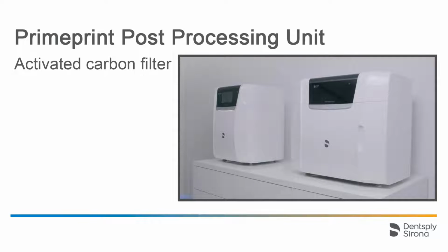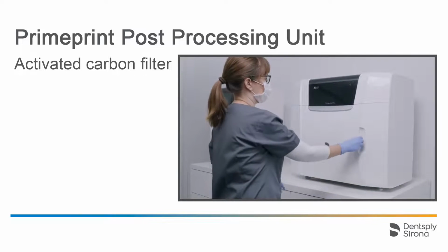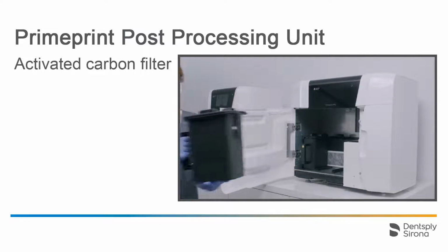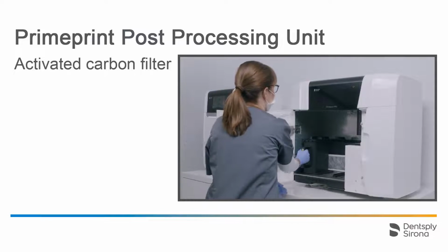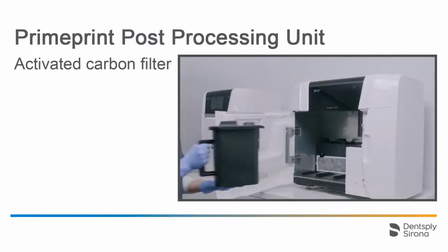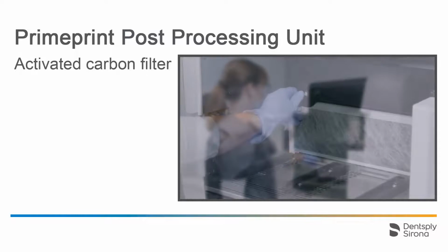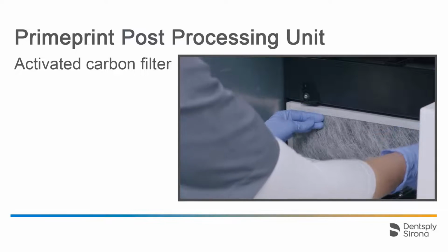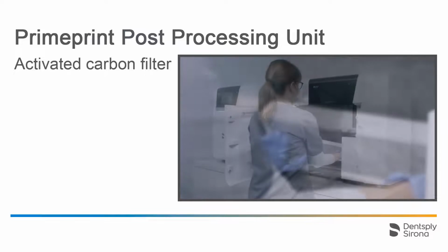Now we come to the exchange of the carbon filter in the post-processing unit. Before you start to work on this, please make sure to disconnect the device from the power supply. We remove both washing containers since the filter is installed behind them. We turn both locks 90 degrees counterclockwise and pull out the filter with the small flaps which are attached to the left and right of the filter.